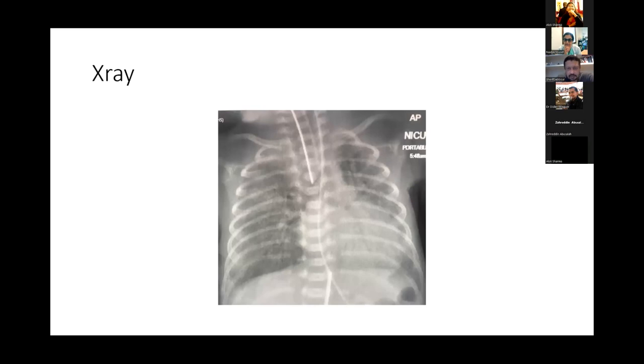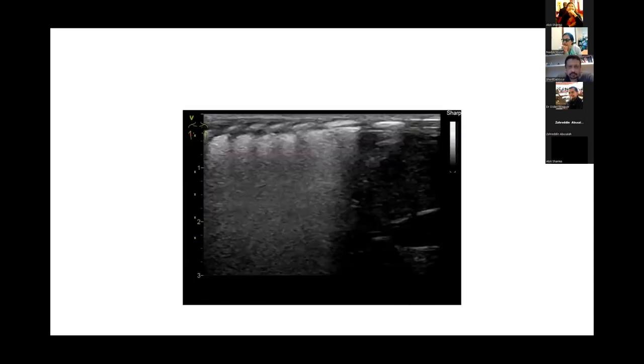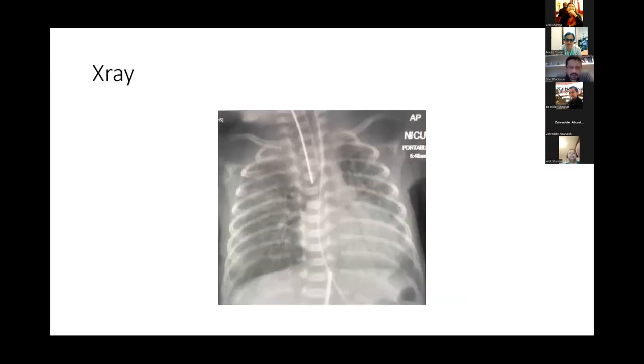So PIE is emphysema, right? Yeah. I don't have much experience on that because I don't see it much. But what would you expect to see in emphysema? A bit of wet lung, small areas of cystic areas on the X-ray. What are you seeing on the X-ray? Here on the X-ray, I could see some cystic areas that are air-filled, right? Air-filled. We're looking for air.